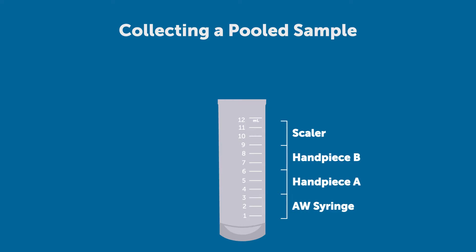To take a pooled sample, you'll take a little bit of water from each device — a little bit from the air water syringe, a little bit from each handpiece, and a little bit from the scaler. In our little test unit we have three water lines; you may have four or more.